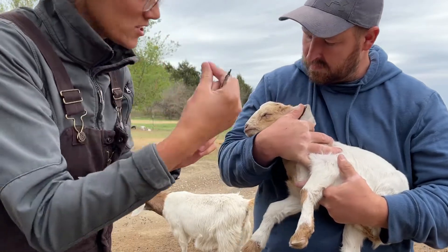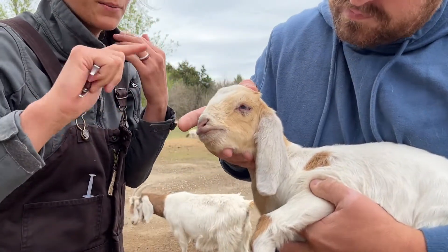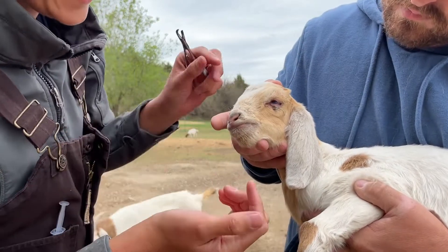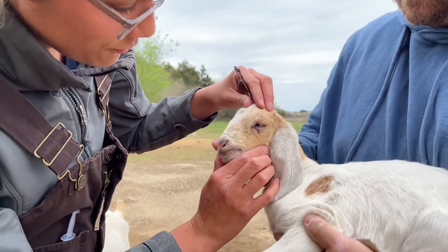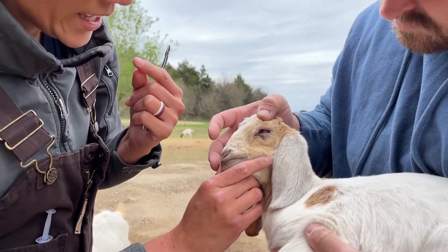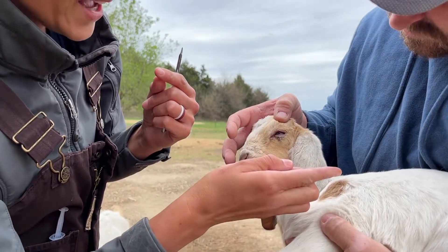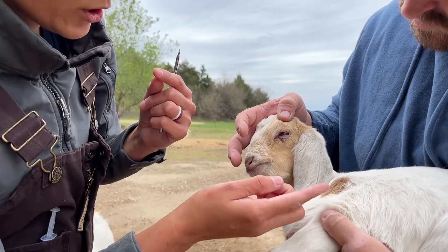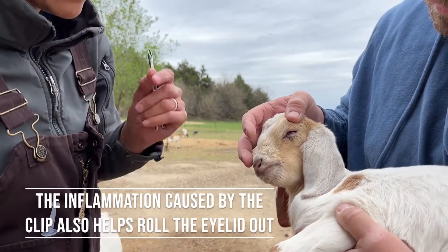Just that little bit of a squeeze on the tissue helps pop that eyelash that's been rubbing on her eye away from the eye, to let it heal. You can see how her eye is all cloudy from the irritation from her eyelash scratching her cornea. That little clip pops the eyelid out so it will stop rubbing and can heal, and then we'll remove it in about 10 to 14 days.